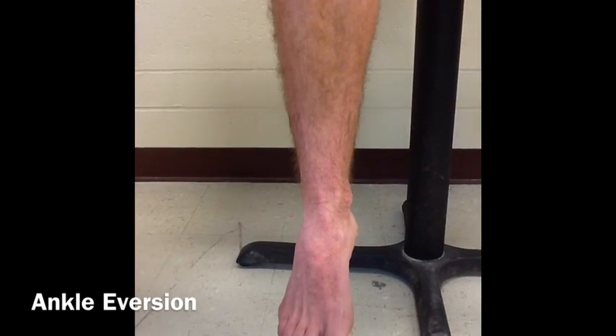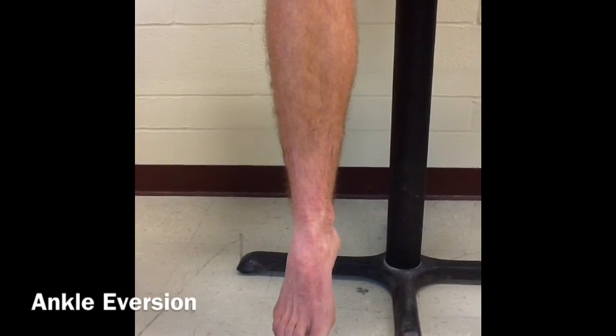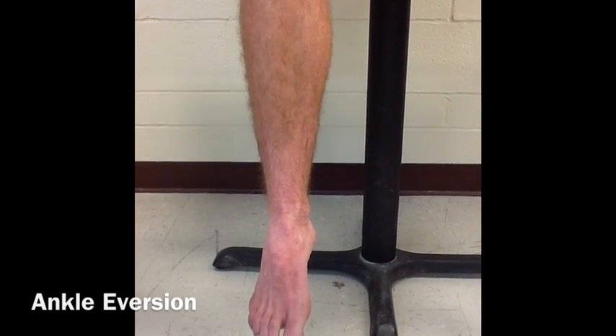The result is 30 degrees range of motion, which is slightly hypermobile, as the normal range of motion for eversion is 15 to 25 degrees.